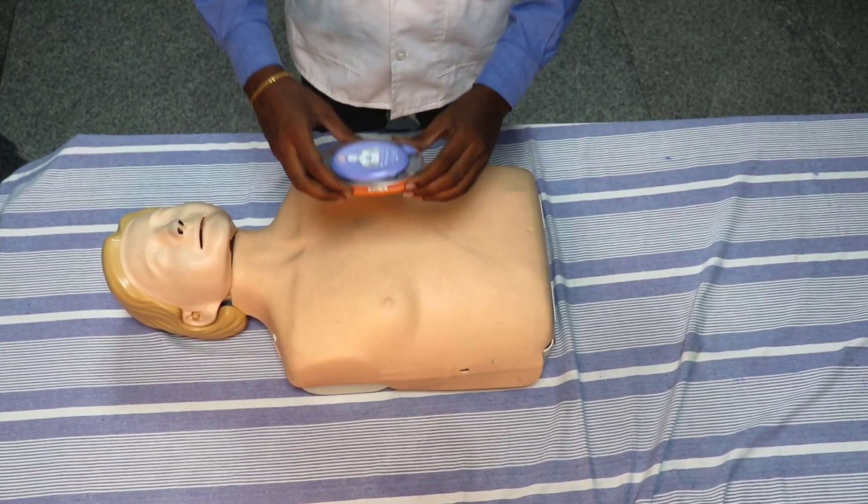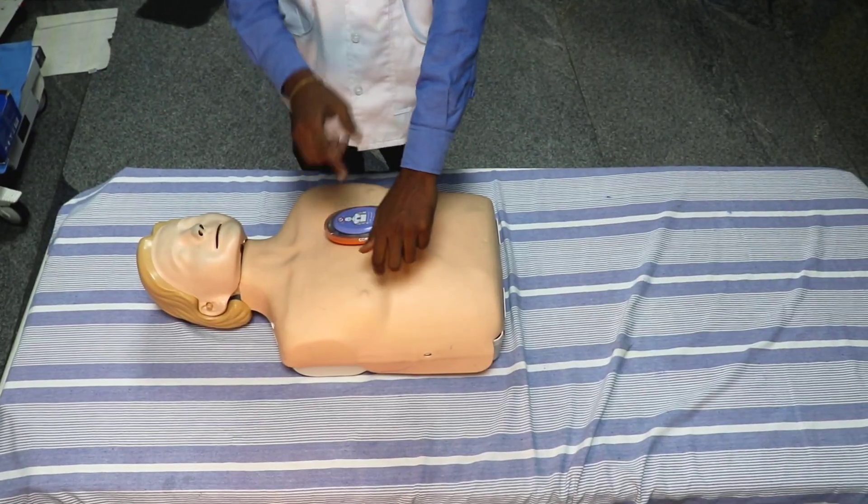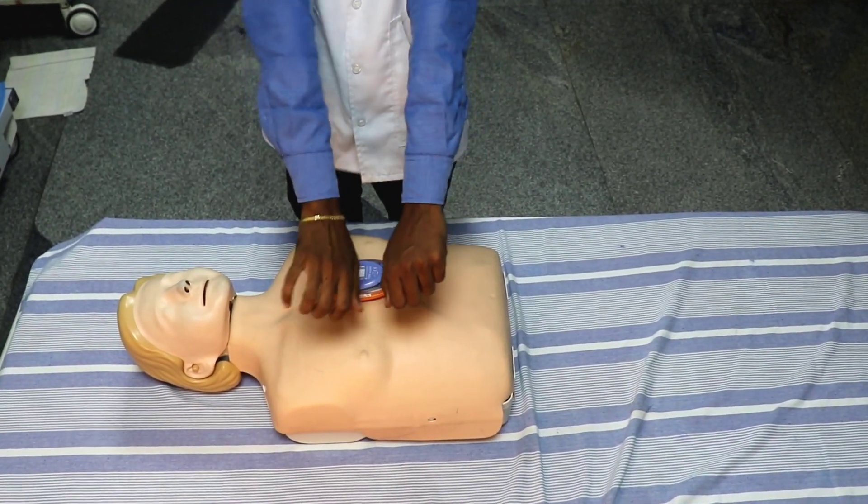Communication mode — connection to defibrillator. Every step of CPR is instructed through voice command. Let's see how to give proper CPR.